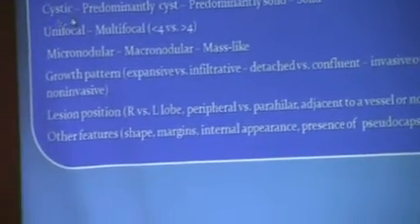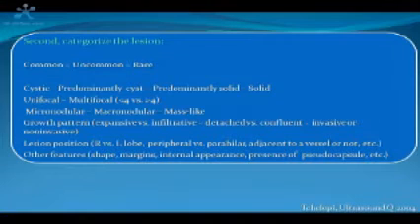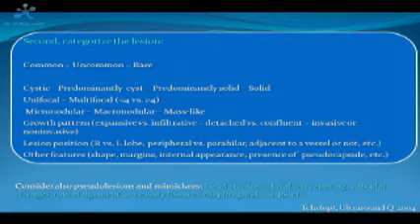We must consider the structure of the lesion, being cystic or solid or intermediate, the number of lesions, single or multiple, less or more than 4, the size of the lesion, the pattern of growth of the lesion, the position of the lesion within the liver parenchyma, and we must also check a number of other morphological features.